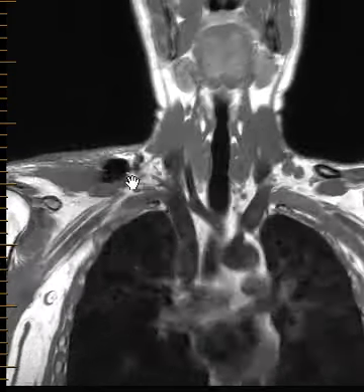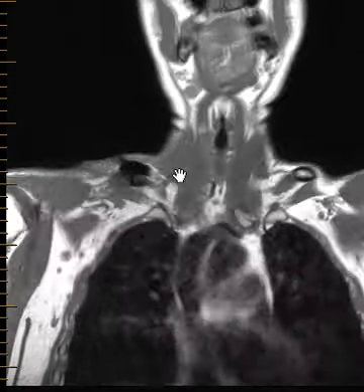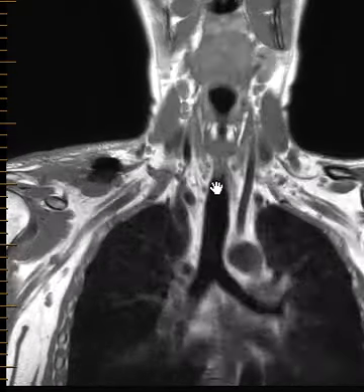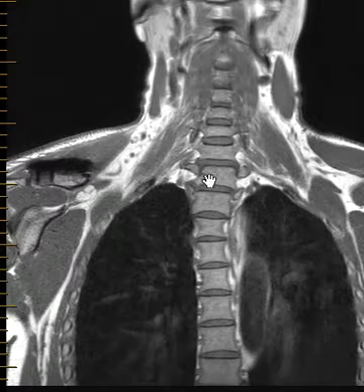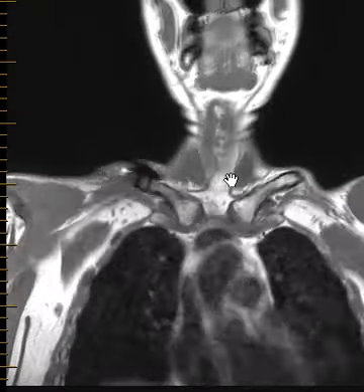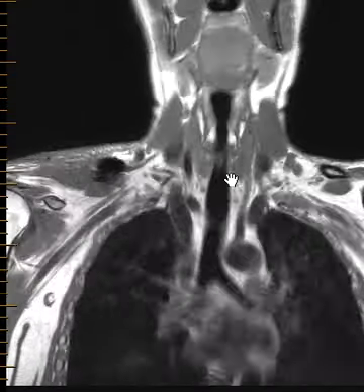The brachial plexus is deep to the clavicle here, so we're going to look at this. Most radiologists like myself don't see a lot of these, so I'm not the best person to give this lecture, but I figured I'd just show you what I've seen here. Most of the time these are normal, but this case has a finding.